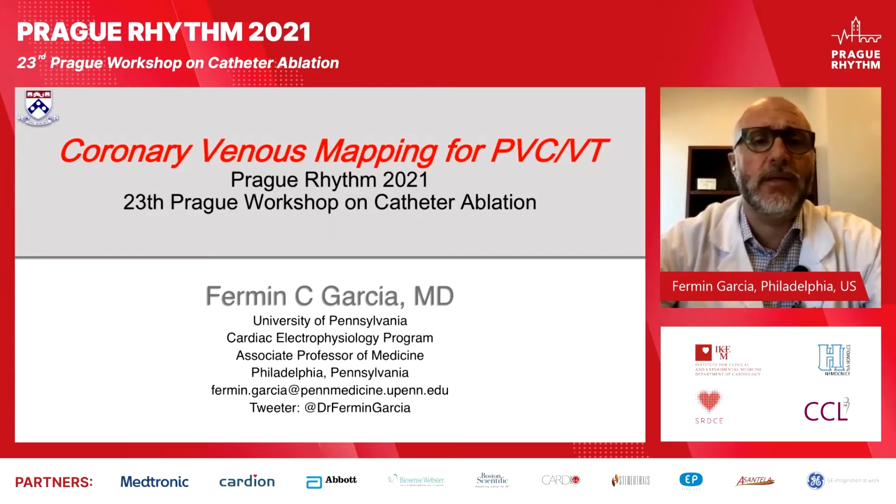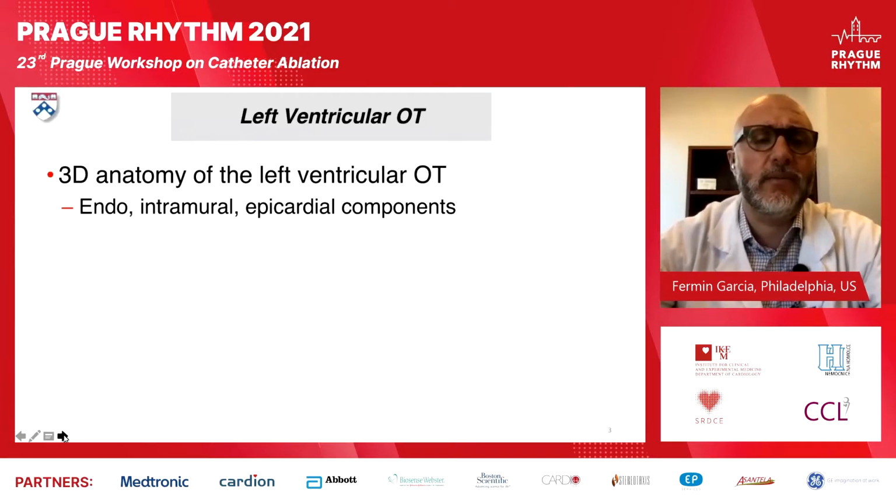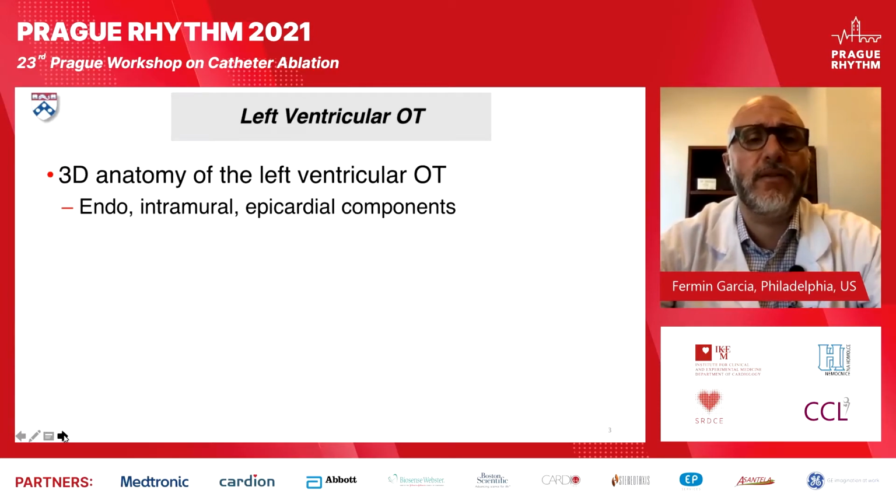I was asked to discuss coronary venous mapping for PVC and ventricular tachycardia. The left ventricular outflow tract is a very interesting portion of the heart, and it's a perfect example of the importance of understanding the 3D anatomy of the human heart.